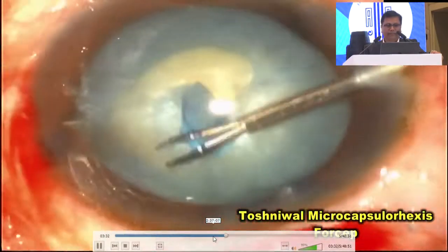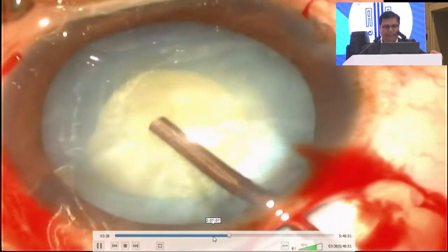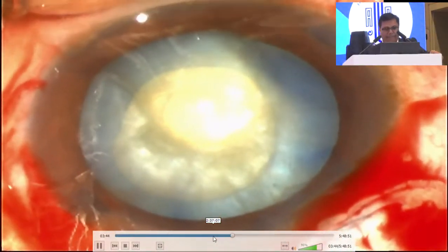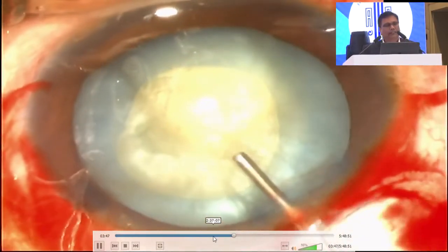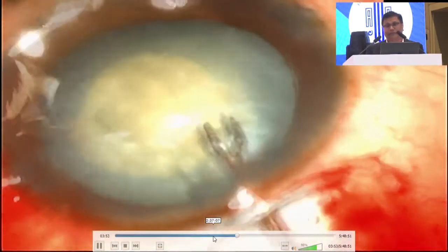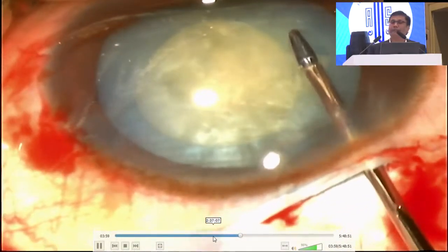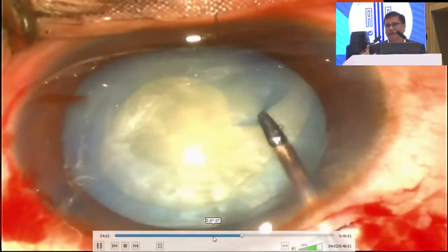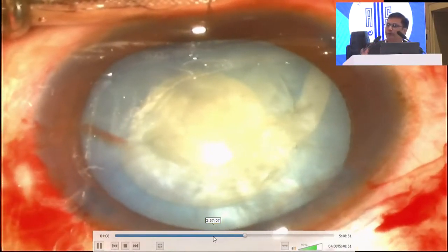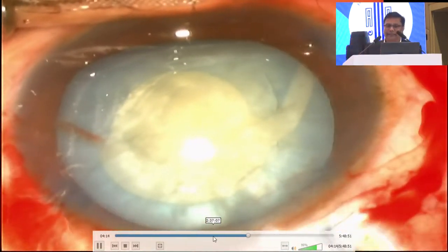We have managed. Actually, you have to do a very small tiny rhexis, but I thought that we can manage. And while removing, debulking the pressure in the bag, this is actually an adequate rhexis, but I thought that we will increase it a little bit. That was my mistake. So although you are having an excellent instrument in your hand, you think otherwise I would have managed with that small rhexis. It was not very small, it was 4 to 4.5. But this is what we think at that time, and suddenly it has run away.